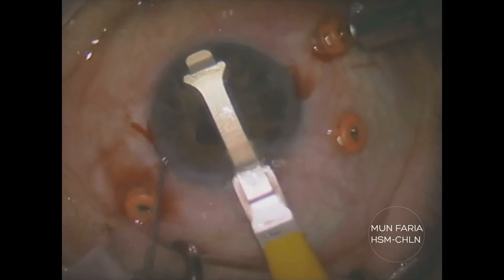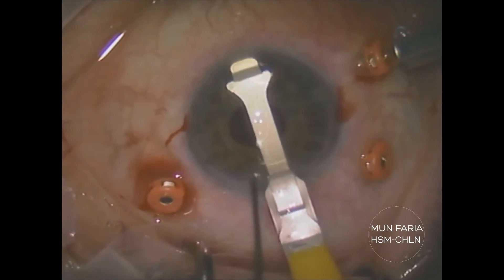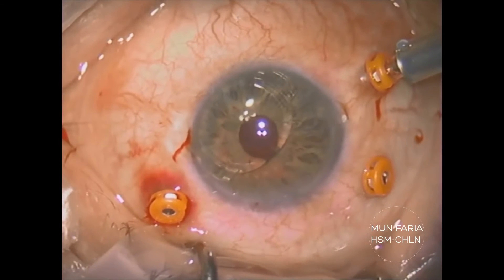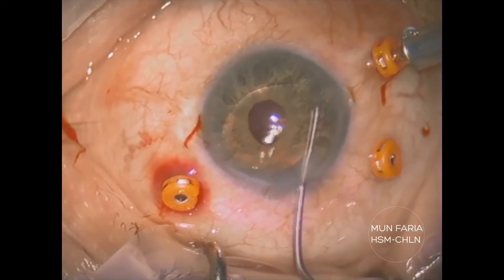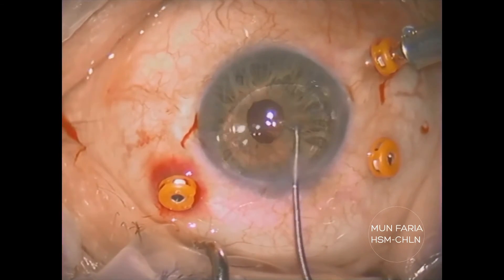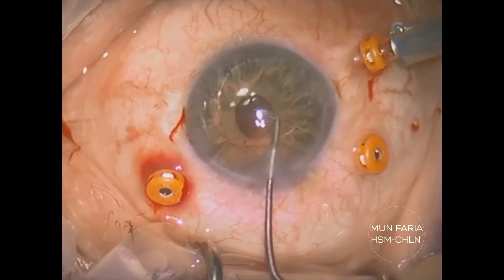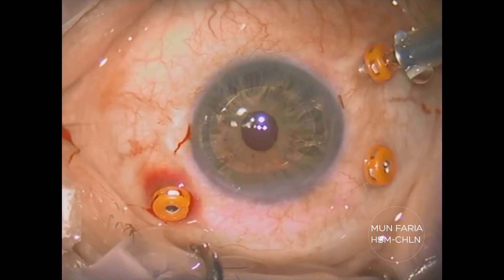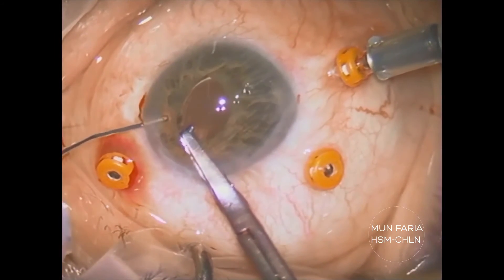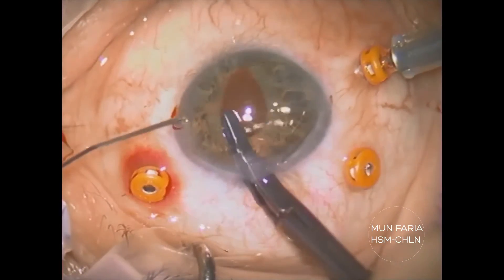Retropupillar iris claw IOL is more and more the procedure of choice for most surgeons for correction of aphakia with no capsule support; however, an incision of 5.4mm is needed because of the PMMA material. Artiflex is a foldable IOL for correction of myopia, has only negative diopters, and needs a 3.2mm corneal incision.